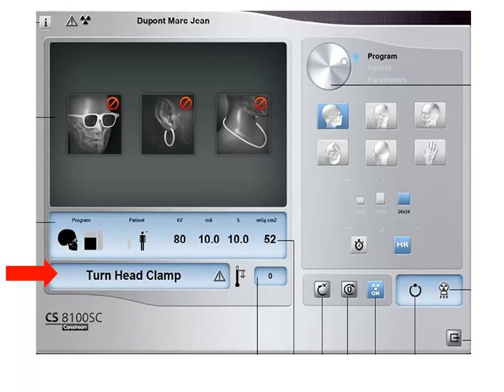System status screen. Displays alert or warning messages originating from the unit. Generator cooling indicator. Indicates the automatic cooling time required before the next acquisition. X-ray dose. Displays the dose that will be emitted during each acquisition. Reset button. Resets the unit to the patient entry position. Parallel position button. Leaves more free space around the unit when it is not in use by placing the rotative arm in a position parallel to the unit head.